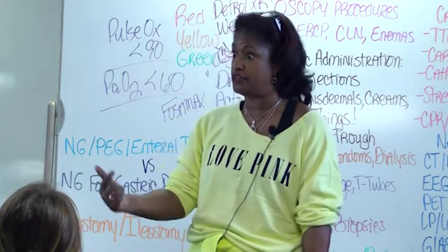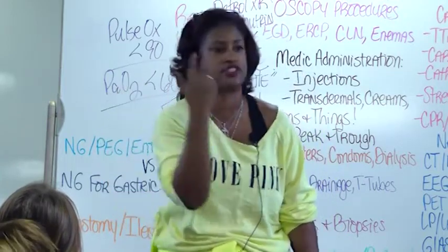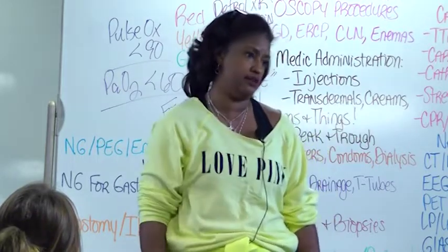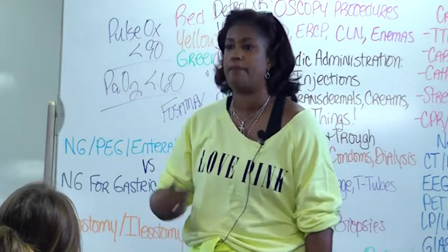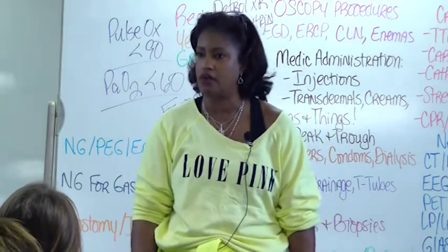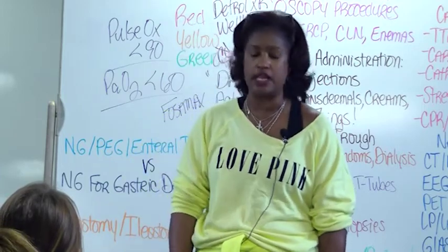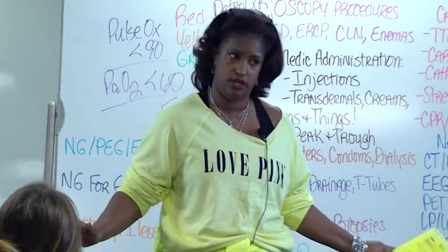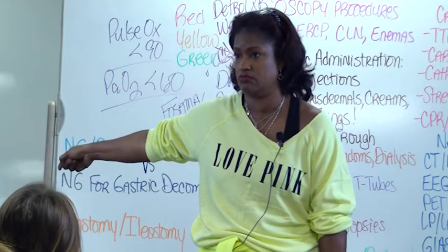Well, if you bothered to check the pH, you would have known that the duodenum has a different pH than the stomach. The pH of the stomach is acid. The pH of your duodenum is alkaline. The pH of your lungs is alkaline. It's so easy to check the pH. You're never going to get this wrong. You're never going to blow this. Do what I tell you, because her mother almost died because you didn't.